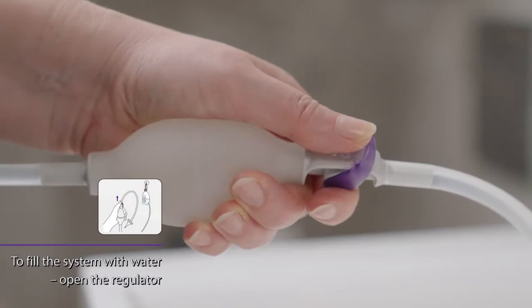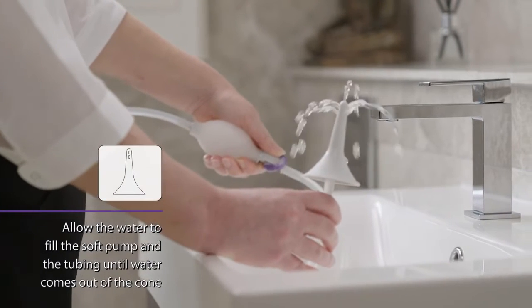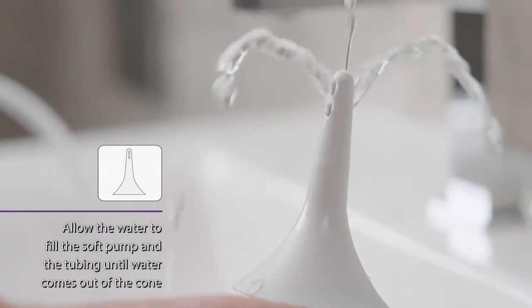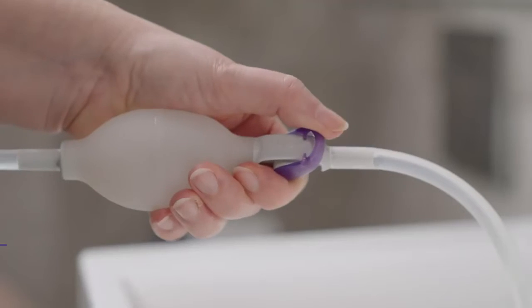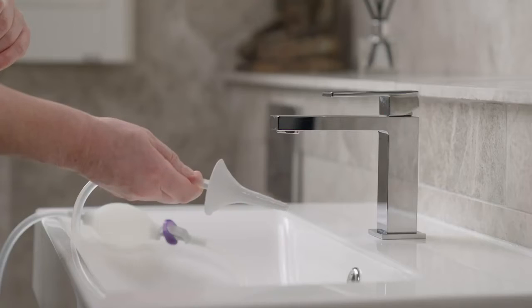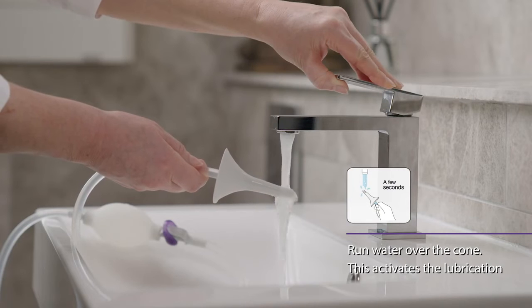To fill the system with water, open the regulator. Allow the water to fill the soft pump and the tubing until water comes out of the cone. This will allow the water to run through the system and expel any air. Close the regulator. Run water over the cone — this activates the lubrication. The system is now ready for use.